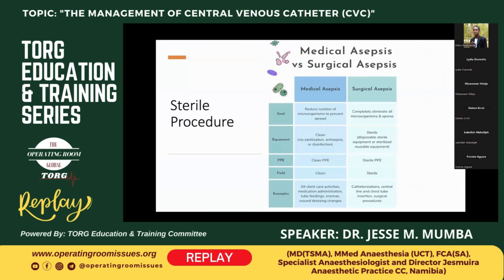This slide is almost the same as I've explained it. I think the most important part is to distinguish between medical asepsis and surgical asepsis. And if you look at surgical asepsis, because central lines are done under surgical asepsis, you can see that your PPE, your personal protective equipment, is all done under sterile. The field is sterile. And these are some of the examples of the things that you do with full sterile precautions. And central lines are just one of them.